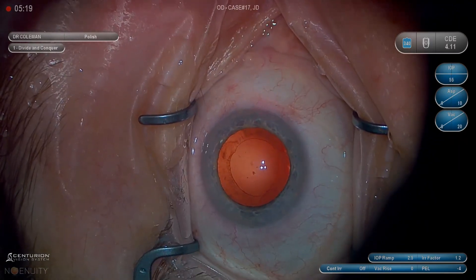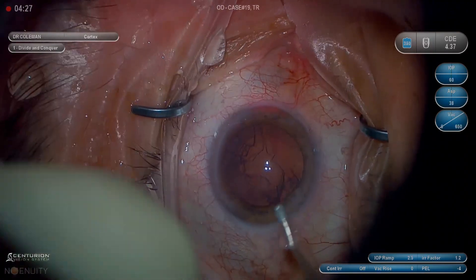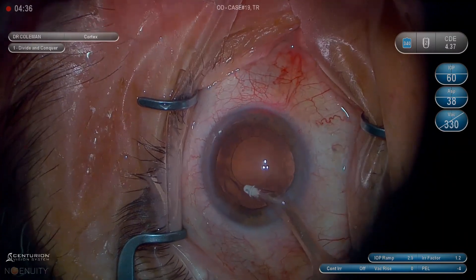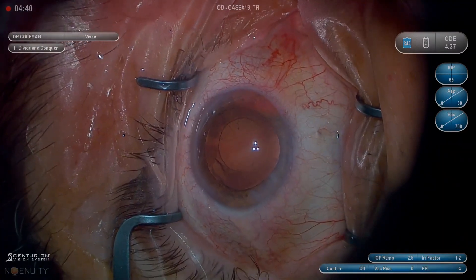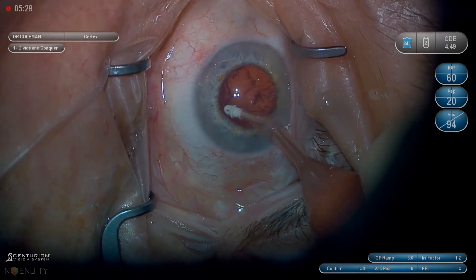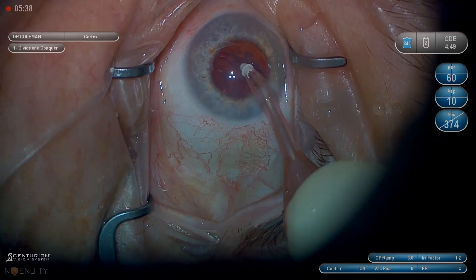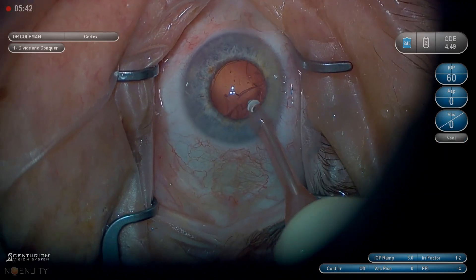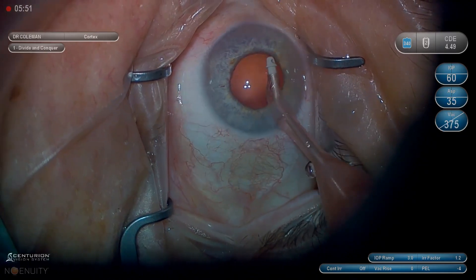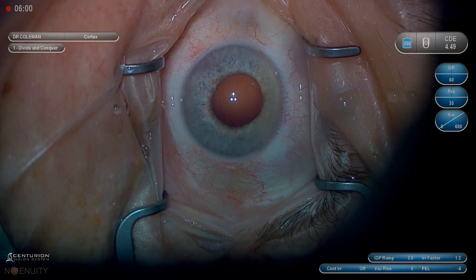When you're engaging the cortex and initially pulling it away at the equator, you want to be pulling tangential to the direction of the zonules — not radial, not towards the center. Moving in an arc allows you to do that. You'll watch these cases and notice I don't always get it in quarters, but that's my general idea. I tend to start on the left side; some people like to get the sub-incisional first. I'm not that worried about it — sometimes it all comes out at once, and that's great. I want to engage a portion, remove it, and then not go back and start the next portion right next to where I just left off, because of what's behind that clear open posterior capsule.